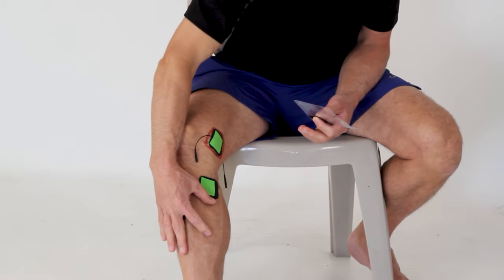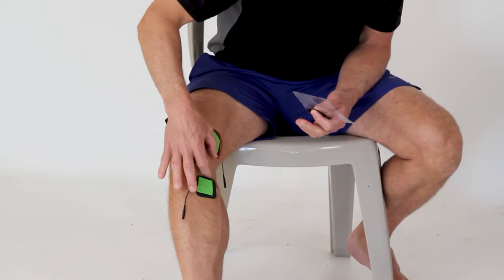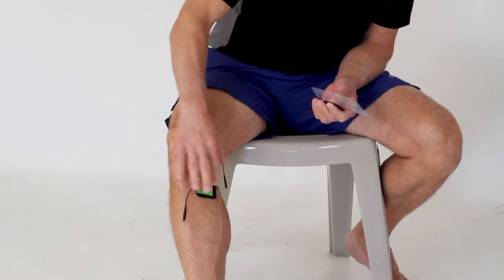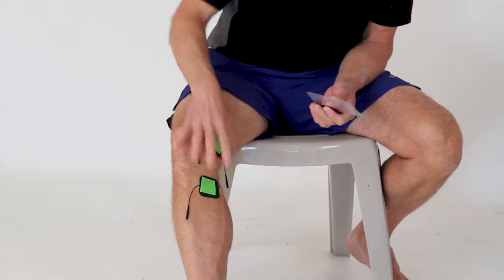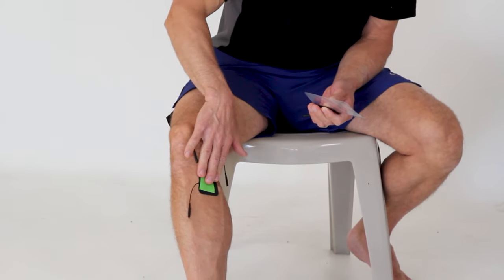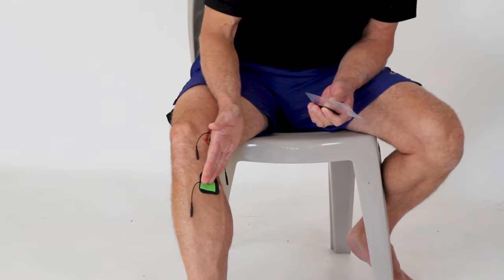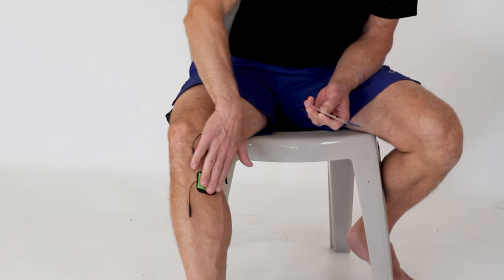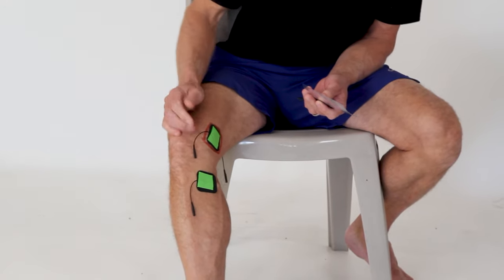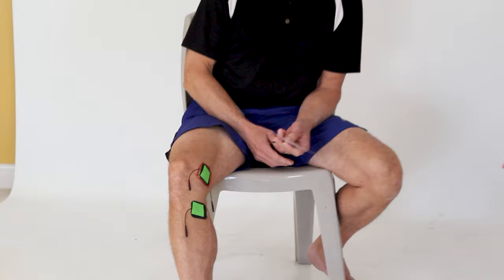You don't want to have this. This is typically where you go. You can vary a little bit and see how it goes. The other thing is I've got some hair on my legs. Once you figure out where the pads go and you like it, you're going to want to shave your hair because it makes the pads last longer and it provides better conductivity for the electricity that's actually going through your skin. So there's a couple of reasons. You may even want to use some soap and water to clean the skin and get the oils off the skin.